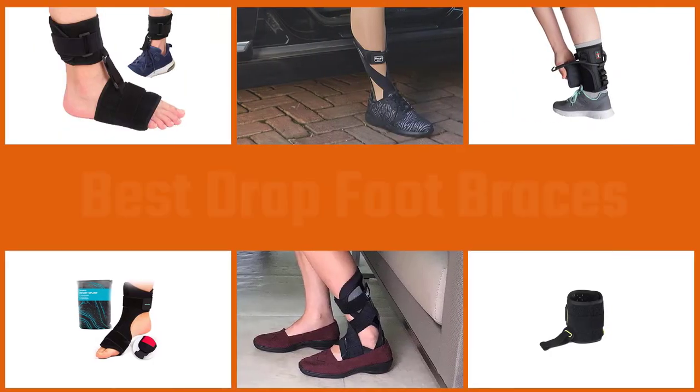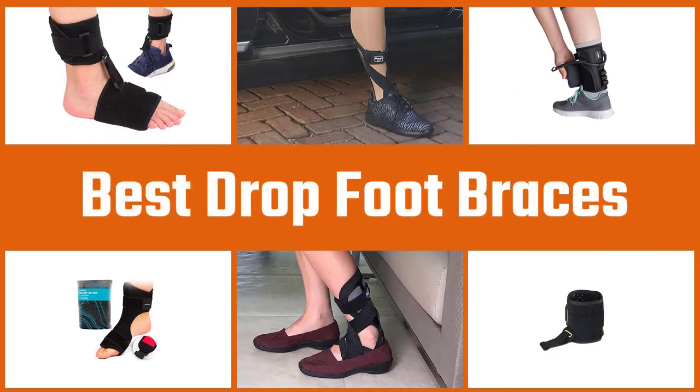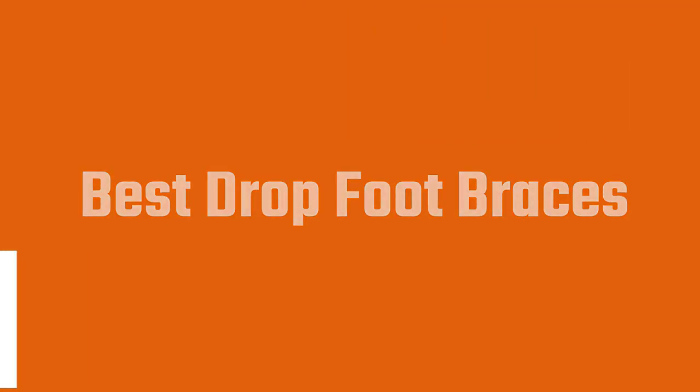Foot drop, also known as drop foot, is a medical condition where the person feels difficulty in lifting the front part of the foot. An AFO brace helps normalize walking patterns. In this video, you can find the five best drop foot braces that will help you get relief from foot drop.